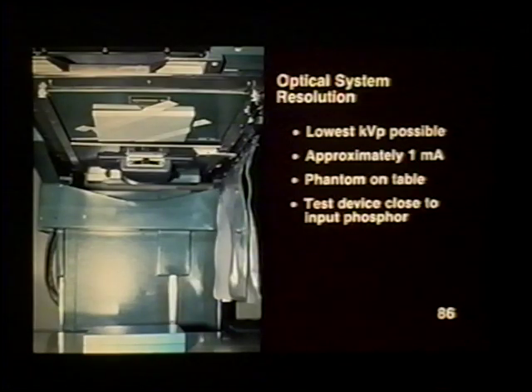Number 87. Wearing a lead apron, view the resolution test tool using mirror optics or a TV monitor. Note the finest wire mesh visible in the center and at the periphery of the field. The test device is marked so that the resolution can be determined by the lead numbers. The higher the number, the finer the mesh. Maximum resolution will be at the center of the field.